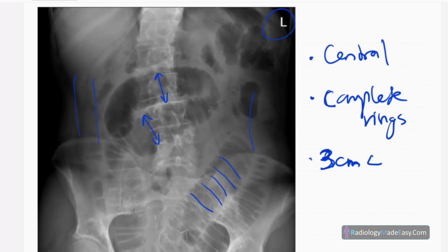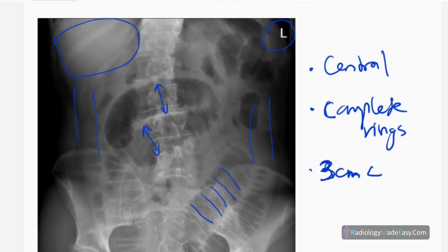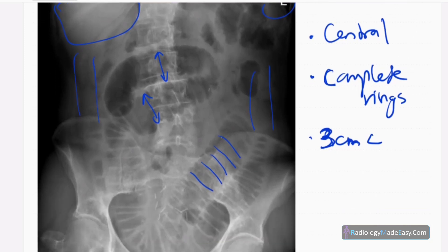There is no large bowel dilation — the dilation is confined to the small bowel. You cannot see any free air within the abdomen. On a supine X-ray, free air appears as the football sign, collected across the entire abdominal wall. There is no air under the diaphragm, and no portal venous gas in the liver shadow.